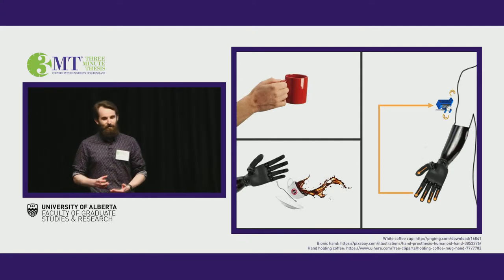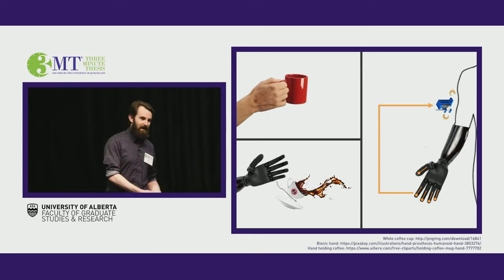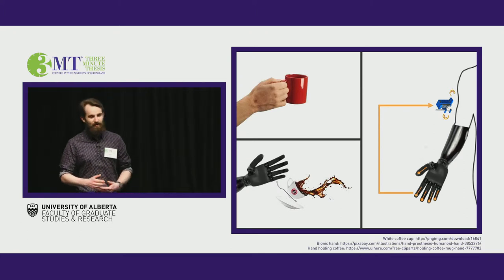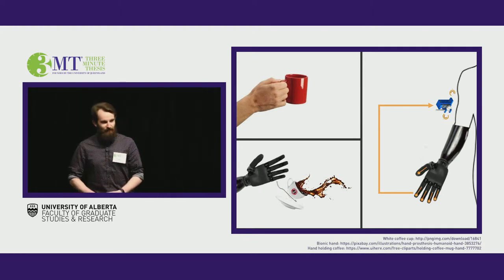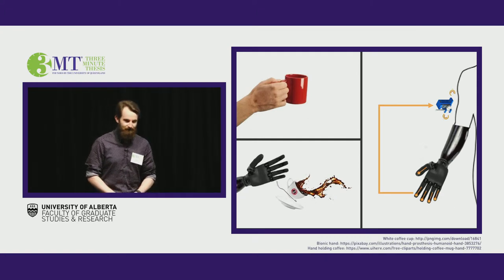See, when a prosthetic user grabs that cup of coffee, they have no clue how hard they're squeezing. So it might be slipping, slipping, slipping, till bang. It hits the floor, coffee goes everywhere, they're embarrassed, humiliated, and they end up losing a bit of trust in their device. And it's exactly for this reason that close to 50% of prosthetic users end up completely abandoning their device and not using it at all.